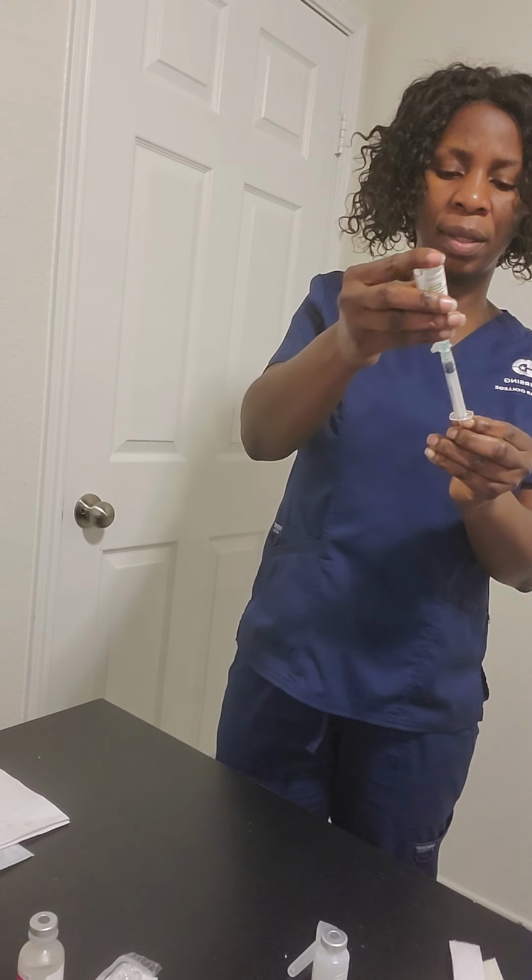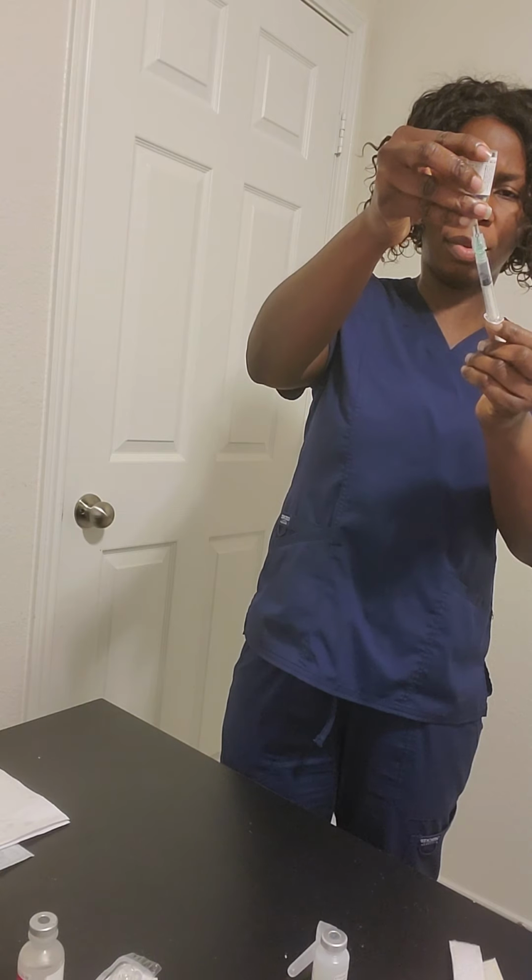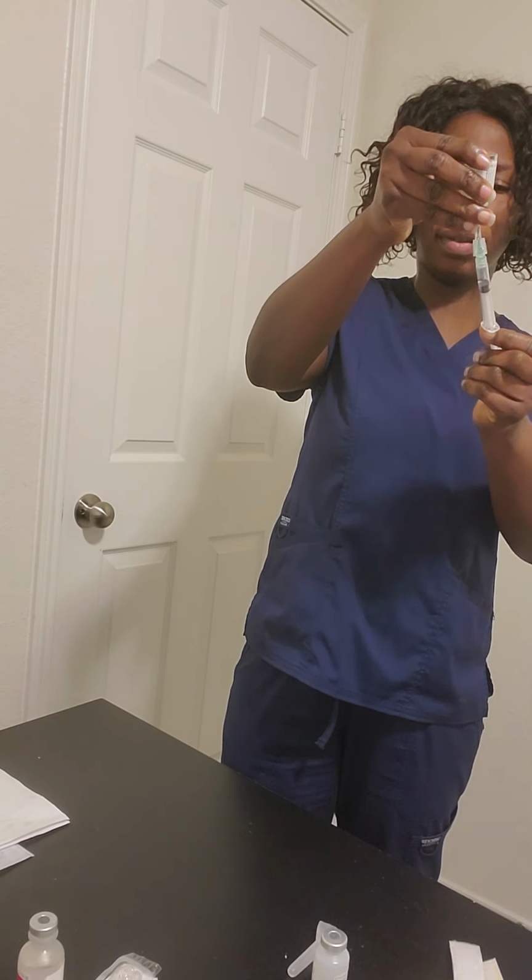And I will draw the 1 gram required that we're going to administer to the patient. I'm going to draw that completely.